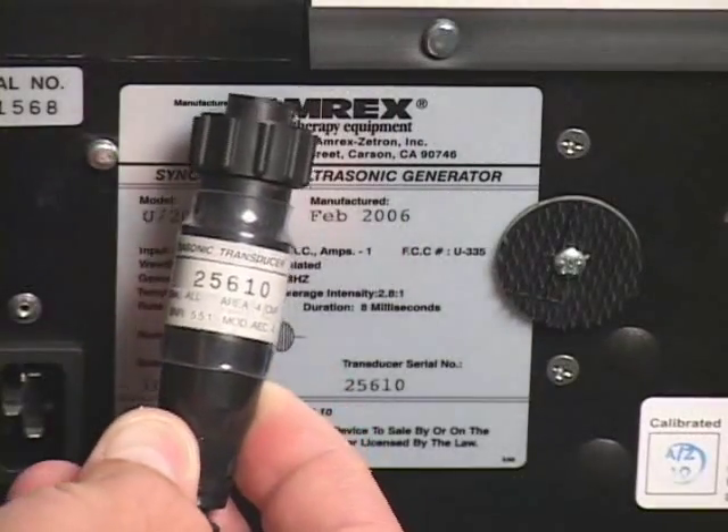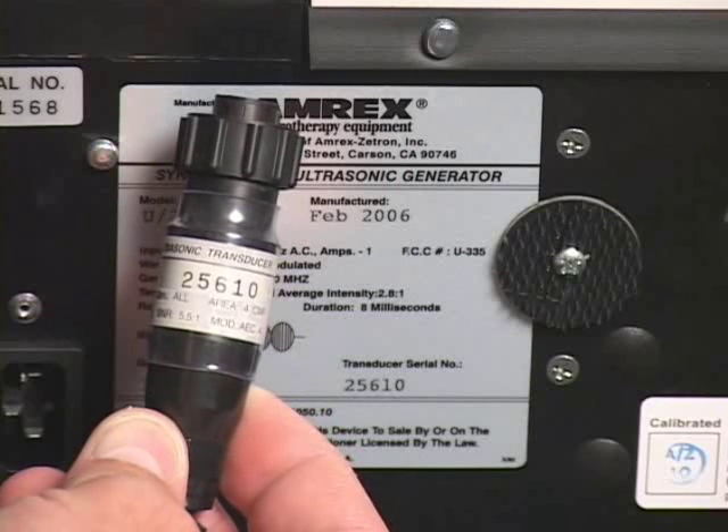US54 generators are equipped with serialized transducers. The transducer or transducers assigned to a given generator must only be used with that generator.